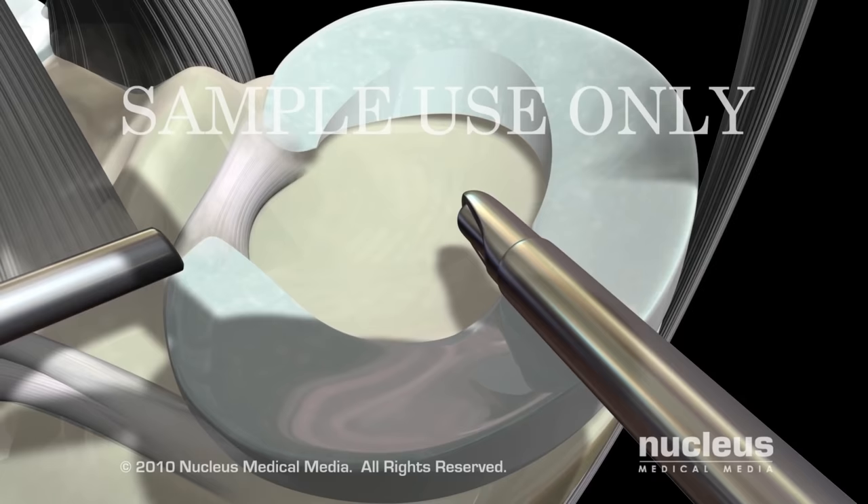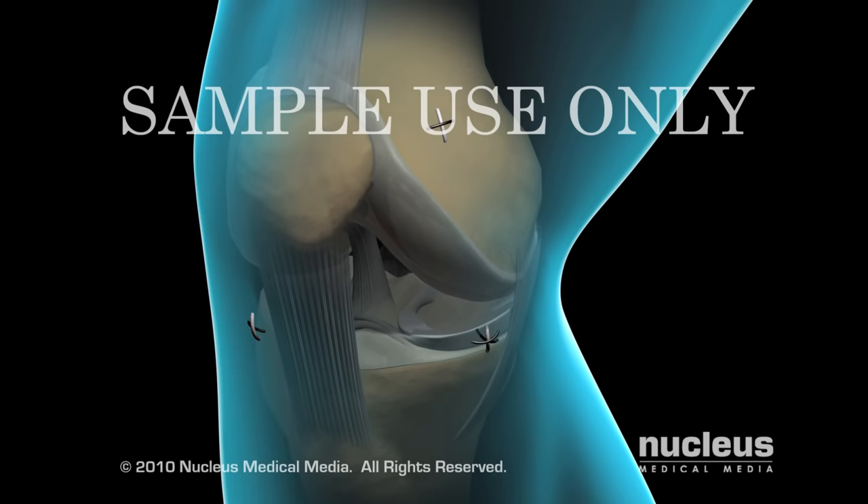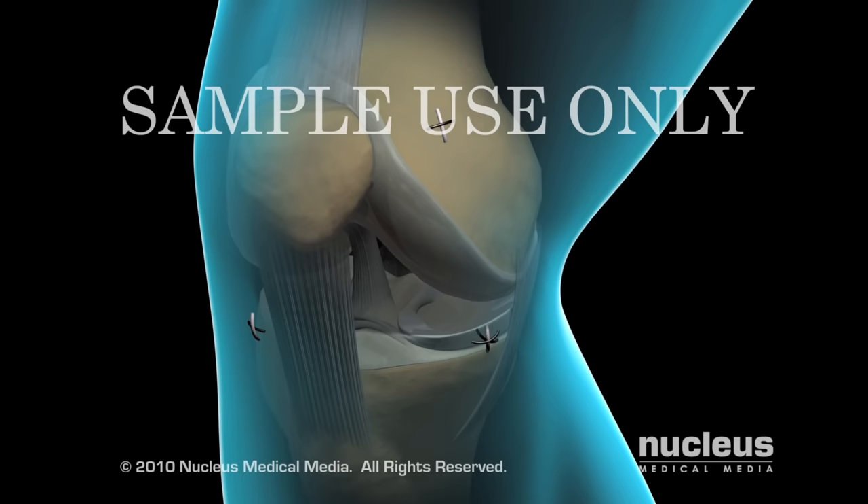At the end of the procedure, your surgeon will again carefully examine the entire knee for any areas of bleeding or other damage, remove the arthroscope and other instruments, and close each of the keyhole incisions with a few sutures.